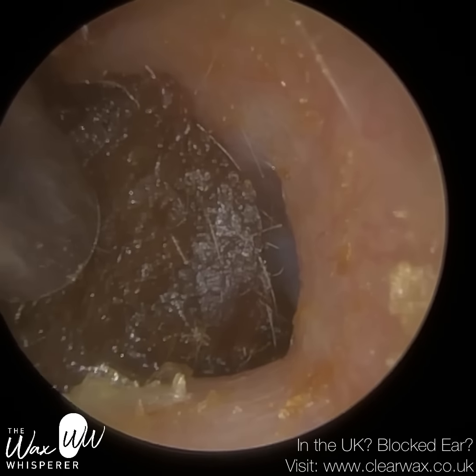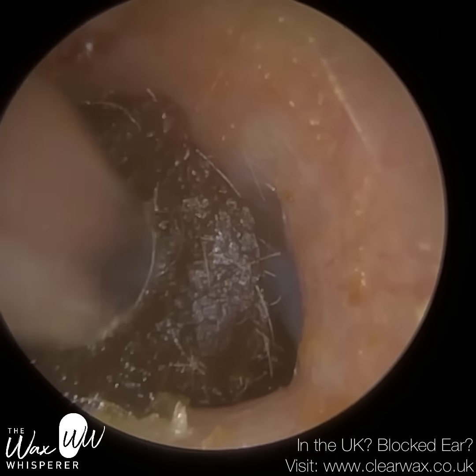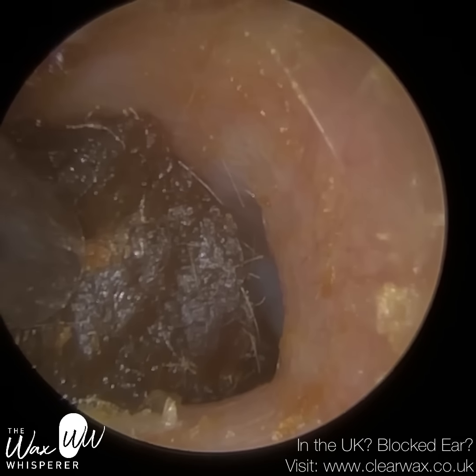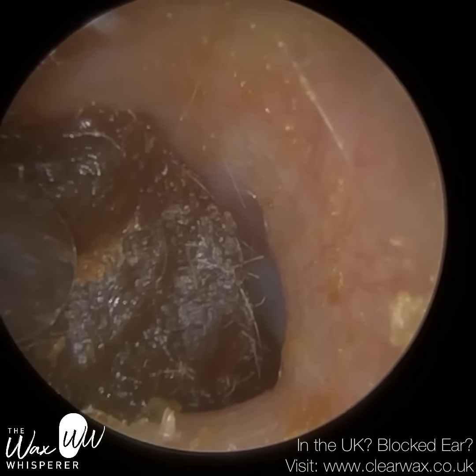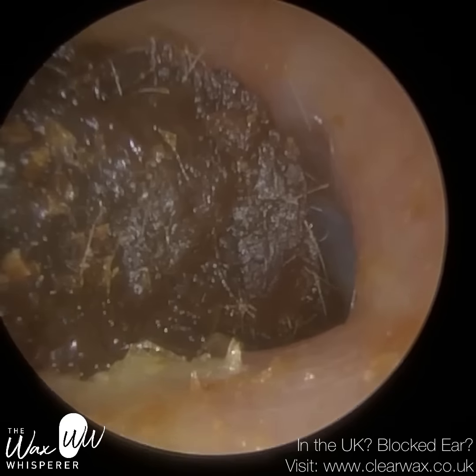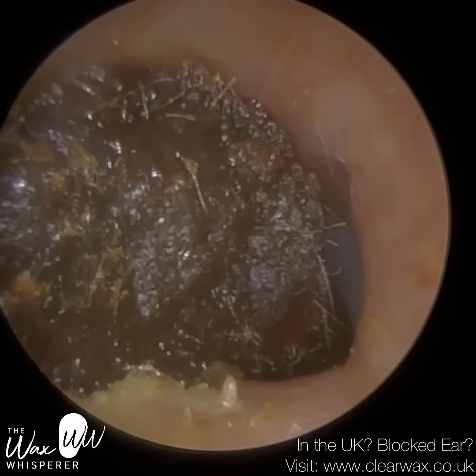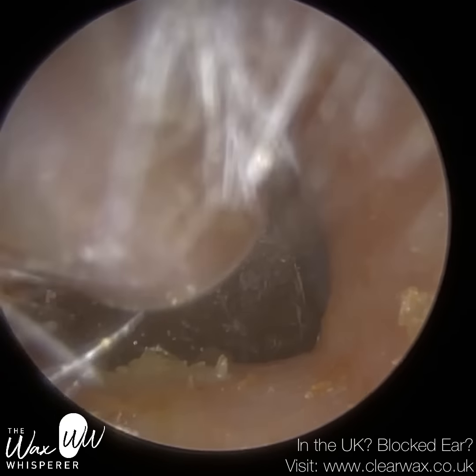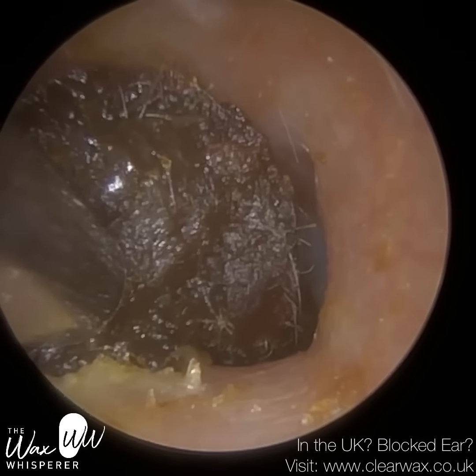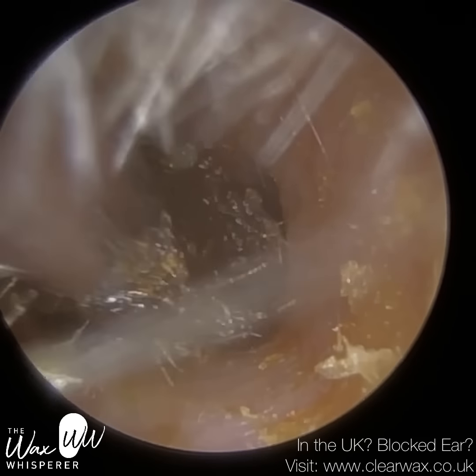And you can just see the eardrum just to the back, around 3 o'clock, just to the right of the sucker right now. That's just the tinge of the eardrum. That's the posterior, the back part of the eardrum. And if you look at the ear canal at the bottom, it rises and then it dips back down again. So when it rises, at the peak of the rise, we call that the isthmus. That's the narrowing of the ear canal, about 0.5 centimetre away from the eardrum. And at that peak, just like a mountain peak, the ear canal then drops, and that creates a little basin, a little trench. We call it the inferior recess, and we've got wax trapped there. And also here, the anterior recess where I was working on there.